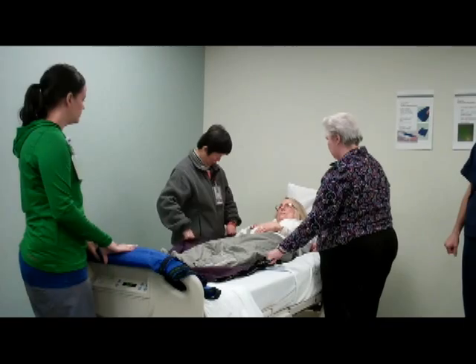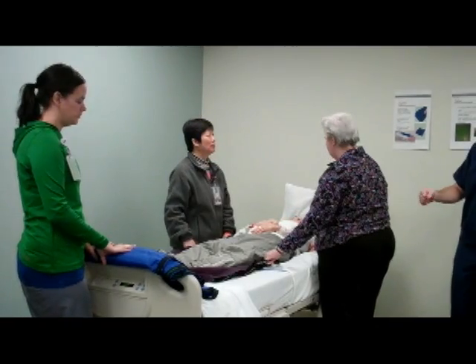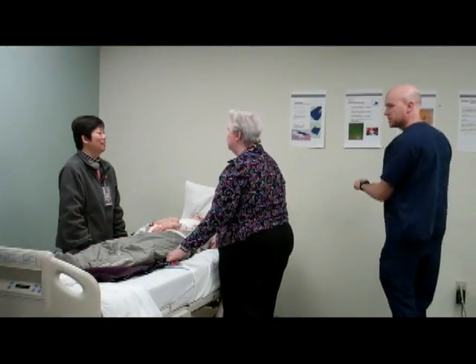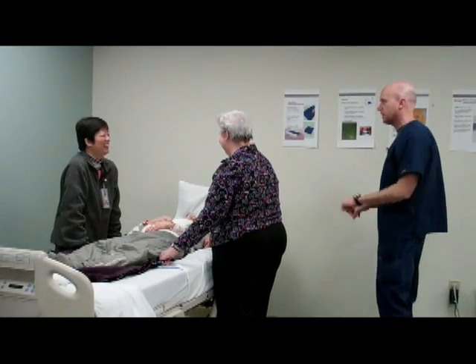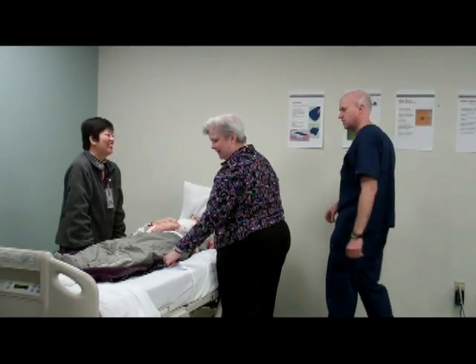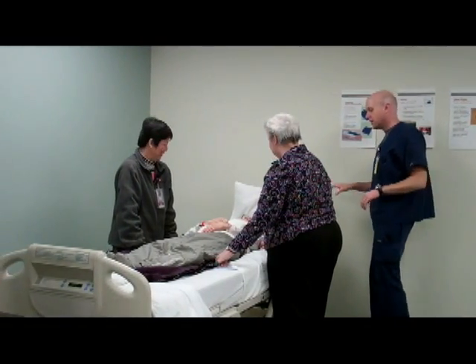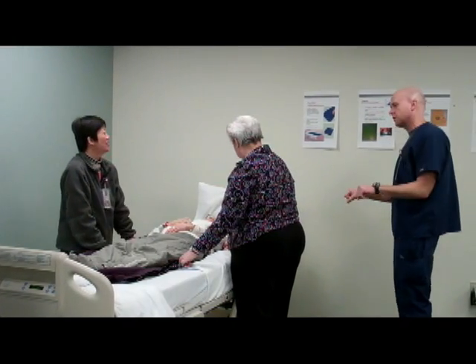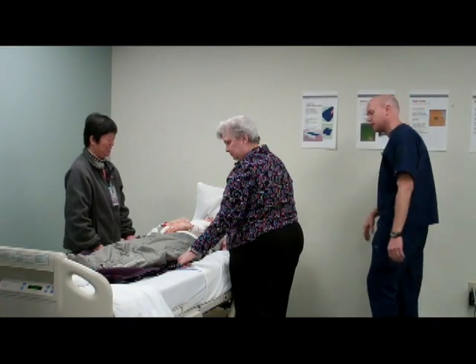Make sure to bend your knees, as we said, neutral lumbar spine. Point in the direction where you're going to go, so you avoid this kind of boosting activity, and step with the top. So Sue, Kai, when you bring her up, just make sure and step into it. Don't twist and torque your spine. Just step into it. Keep your knees bent.